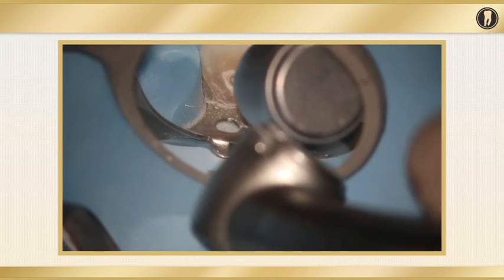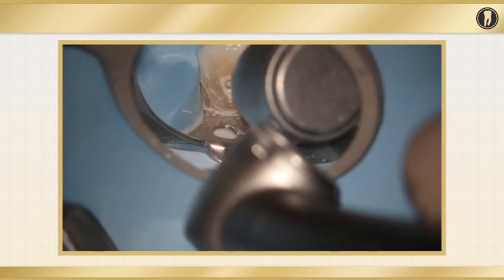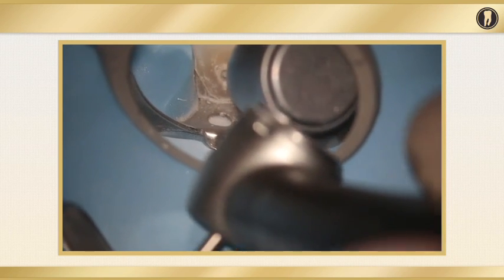If this is a case where it was a difficult chamber, what burr would you want to switch to if you're getting deeper and deeper? You'd want to use a surgical length round burr to help visualize. You can better visualize where you're drilling.